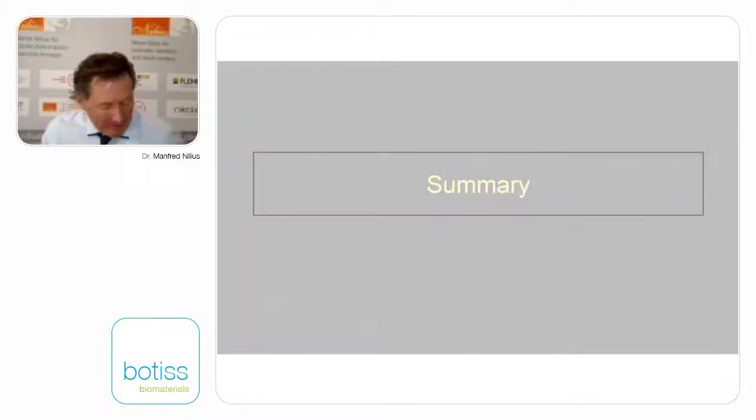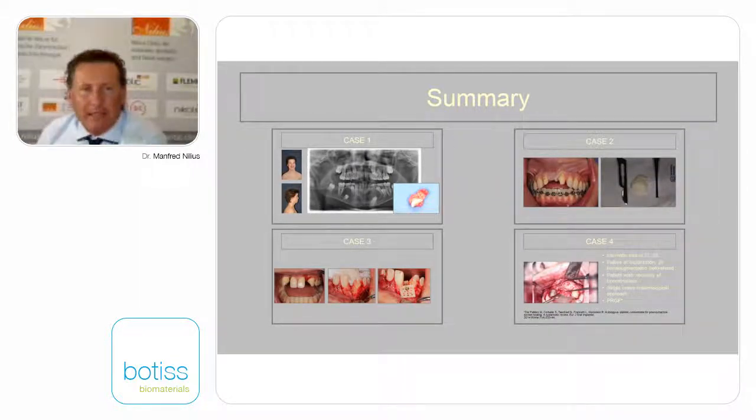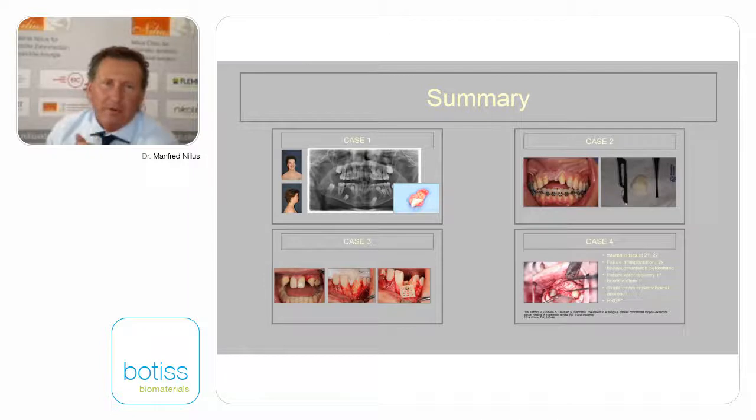The summary, I will come to an end, it's almost 50 minutes. I've shown you our beginning of allogene block and implementation in this first case, the Gorlin-Goltz syndrome and the histological findings. I showed you how to improve the soft tissue in the second case using the Osmed expander, hydrogel expander. We have seen the possibility of monocortical or bicortical maxgraft cortical shields and filling up the gaps.